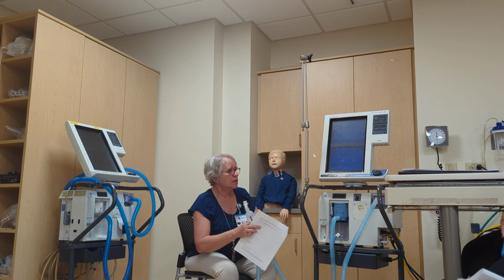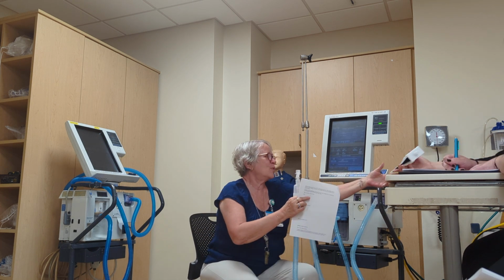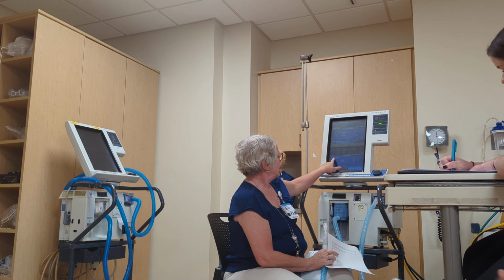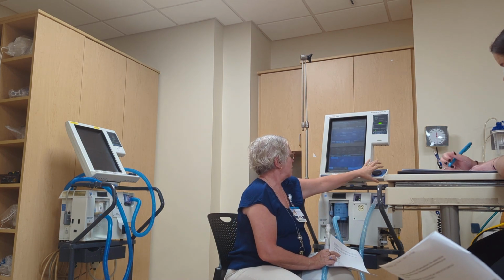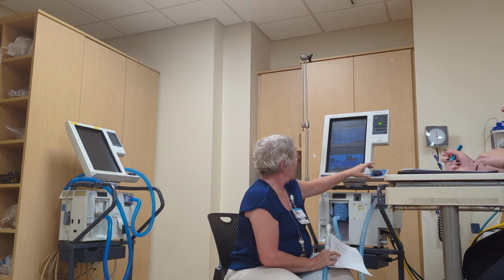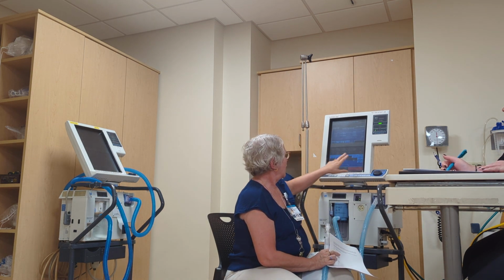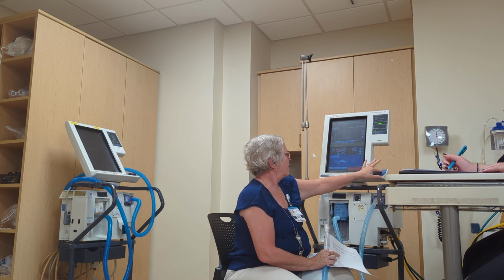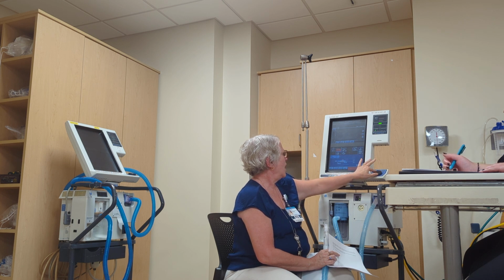So we're gonna go to same patient, maybe. And we're gonna say I want 500 milliliters of tidal volume, all right? So I'm in ACVC.